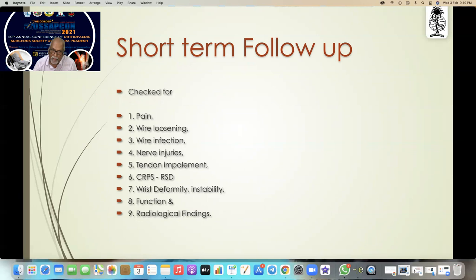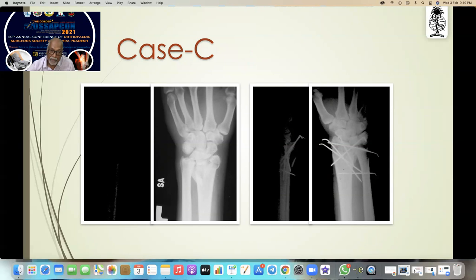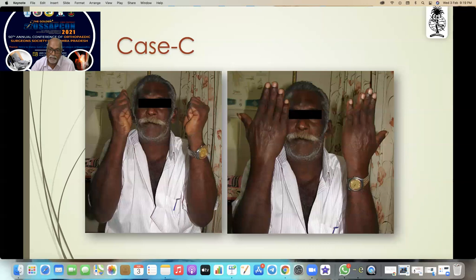We always look for pain, wire loosening, wire infection, nerve injuries, tendon impalement, CRPS, wrist deformity, instability, function, and radiological findings. I'll show you some cases — this one is very badly fractured. This is after reduction and fixation, and this is the long-term result.